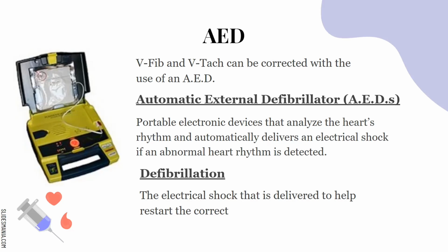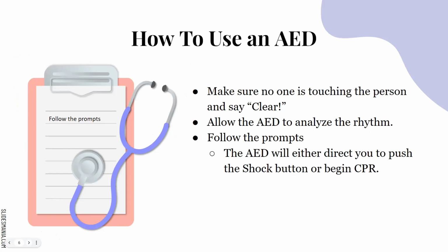So basically, you place this AED on a person if they're passed out and they're not breathing. This actual system itself will look for abnormal heart rhythms, VFib or ventricular fibrillation and VTAC, ventricular tachycardia. They will actually look for those two specifically to help restart the heart.